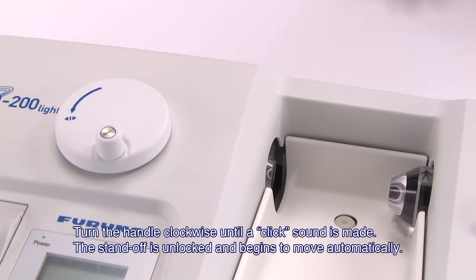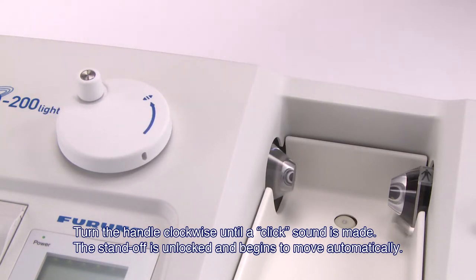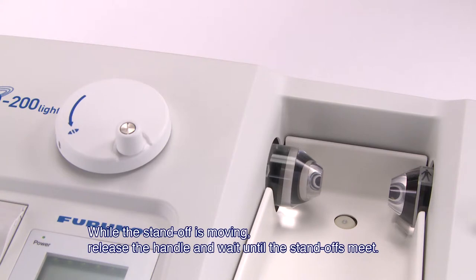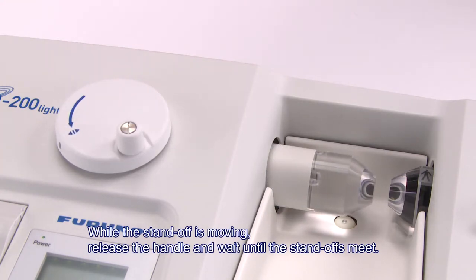Next, turn the handle clockwise until a click sound is made and the standoff is unlocked and begins to move automatically. While the standoff is moving, release the handle and wait until the standoffs meet.